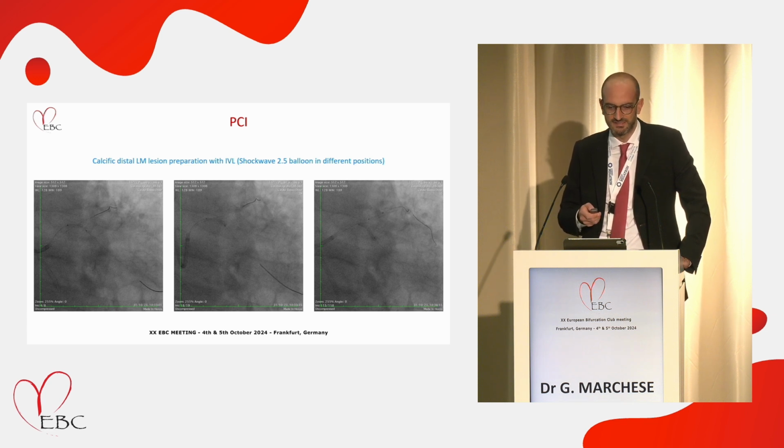And this is exactly what we did, and especially we were able to put the balloon more distal, and this was a signal of efficacy of the treatment.